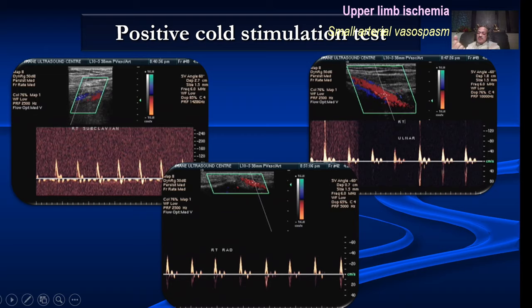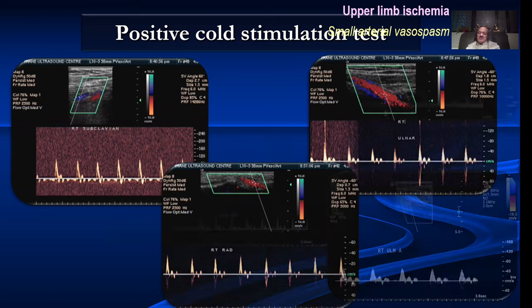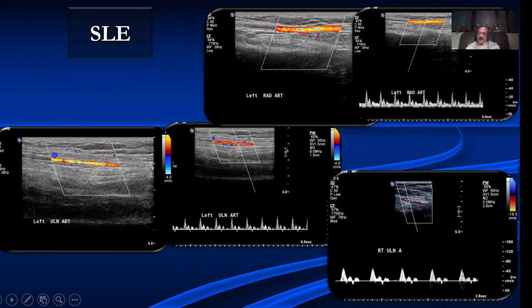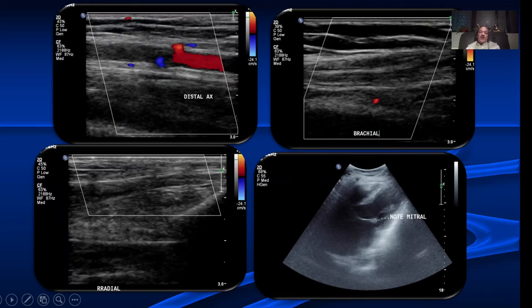A good test for vasospasm is the cold stimulation test. In an abnormal response, after the patient holds and releases the ice, the waveforms do not come back to normal — we persistently see a high resistance waveform and the patient complains of a lot of pain. Here is a young lady with SLE — there was a persistent high resistance waveform lasting almost 20 to 25 minutes, and the patient had severe pain in the hand, almost repenting having done the test.